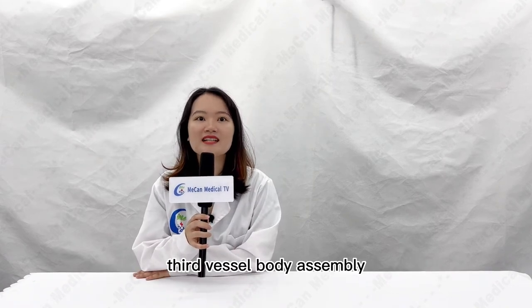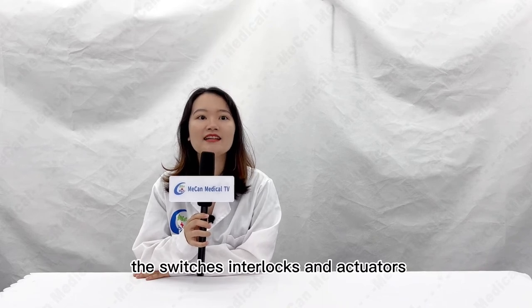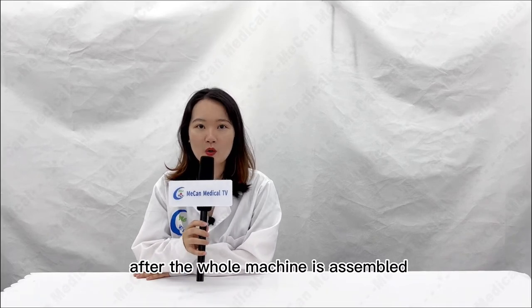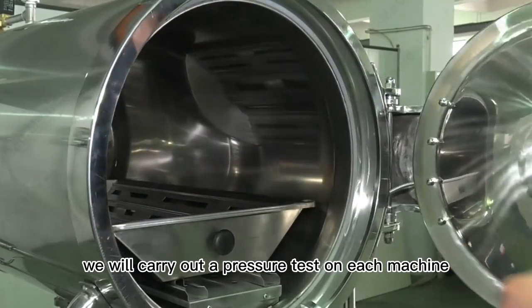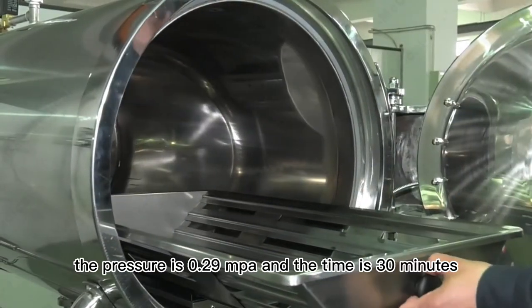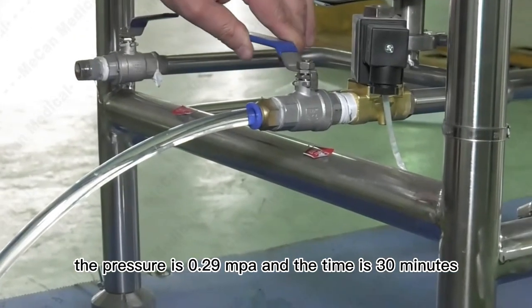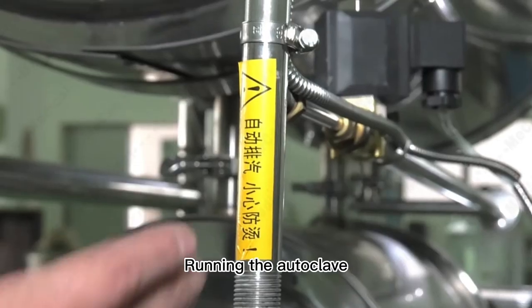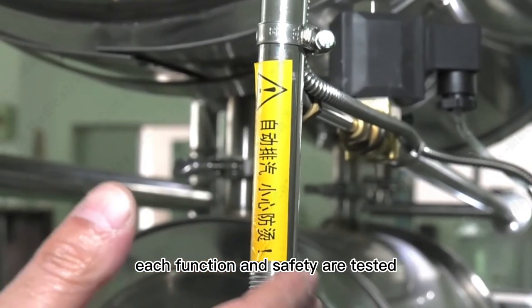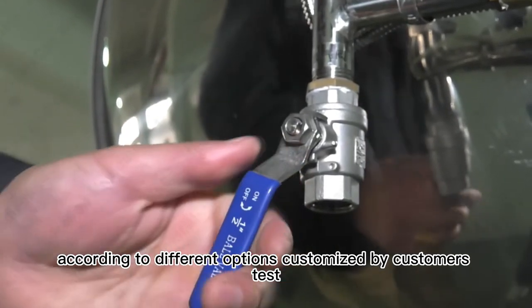Third, vessel body assembly — carefully connecting all the switches, interlocks, and actuators. After the whole machine is assembled, we will carry out a pressure test on each machine. The pressure is 0.29 MPa and the time is 30 minutes. Then the autoclave is run and each function is tested according to different options customized by the customer.